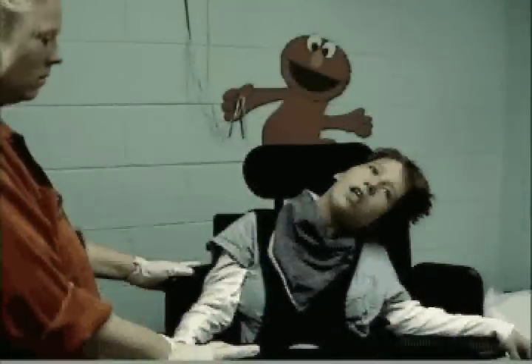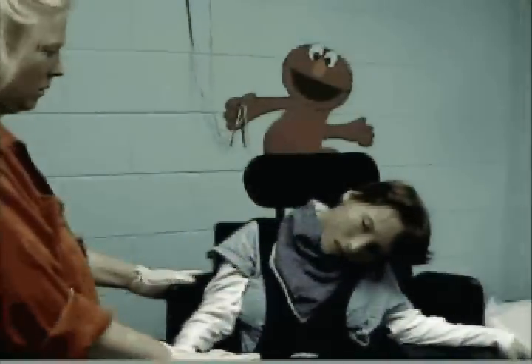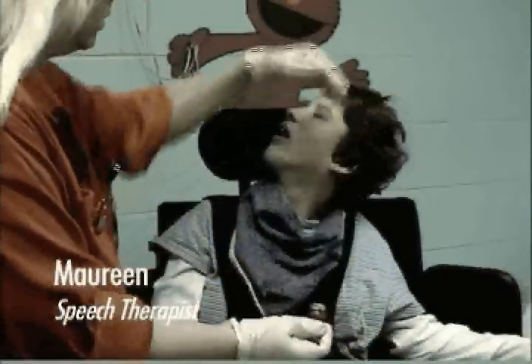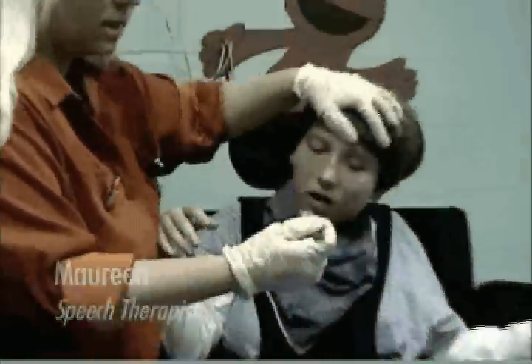With a more traditional headrest, Maureen's going to give a couple of spoonfuls. For safety, Leslie does do better in the other headrest, so we don't want to challenge her too much this way. But just so you can get an idea from the caregiver's point of view, how she needs one hand to hold the head — and then you can see that she fights that.